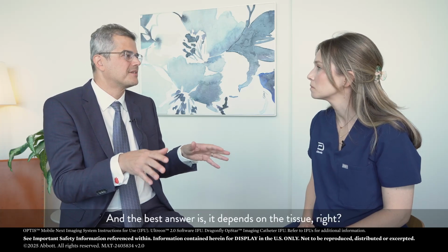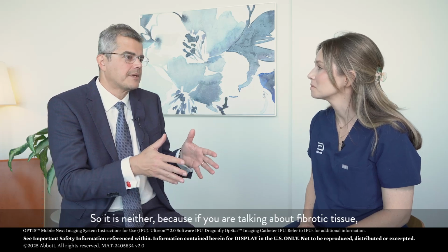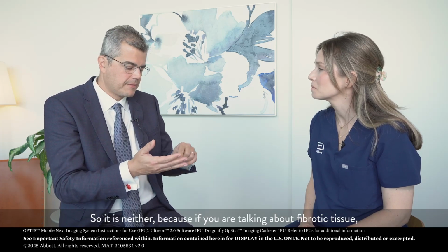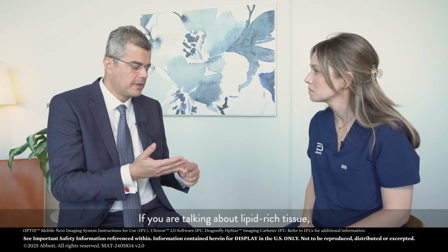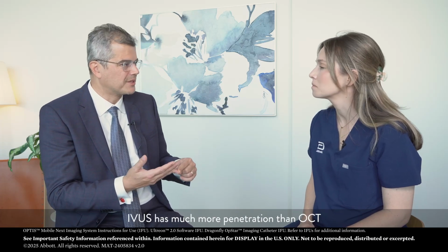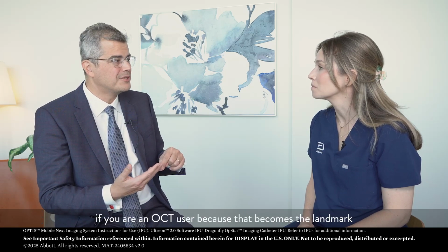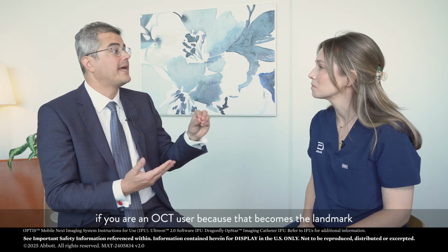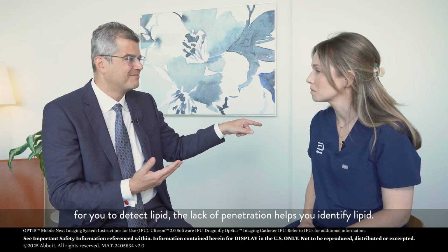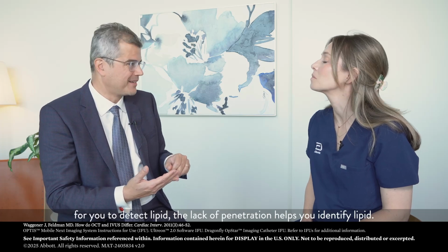Is it OCT or IVUS? And the best answer is it depends on the tissue, right? So it is neither, because if you are talking about fibrotic tissue, IVUS has more tissue penetration. If you are talking about lipid-rich tissue, IVUS has much more penetration than OCT, and you're going to spin this in your favor if you are an OCT user, because that becomes a landmark for you to detect lipid. The lack of penetration helps you identify lipid.